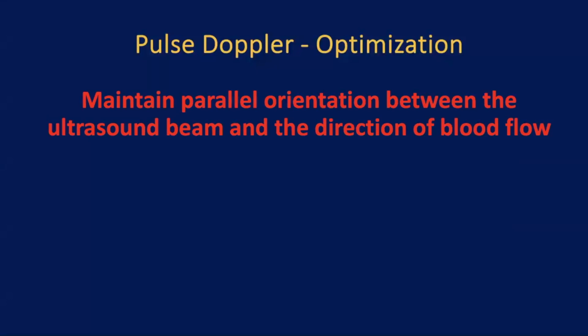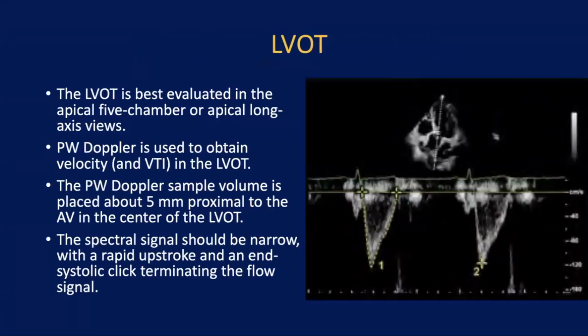And the most important is to be aligned as much as possible. Like in a lot of the aortic pulse, the aorta is going this way and the pulse is at 90 degrees, and there is some flickering. So the LVOT is really one of the most important pulse wave signals that we have. So we should pulse it exactly where we took the LVOT area.